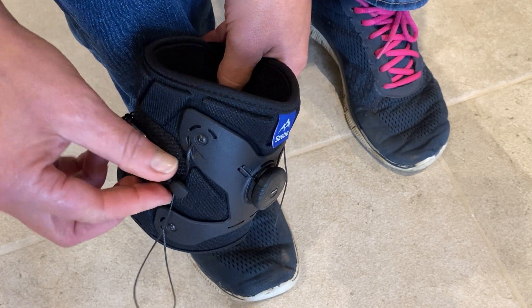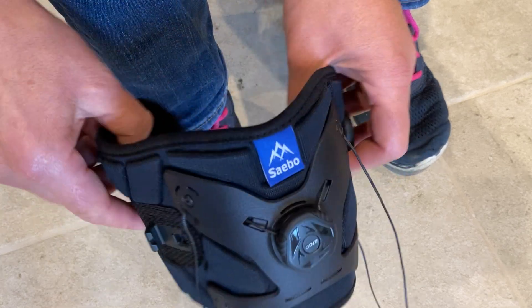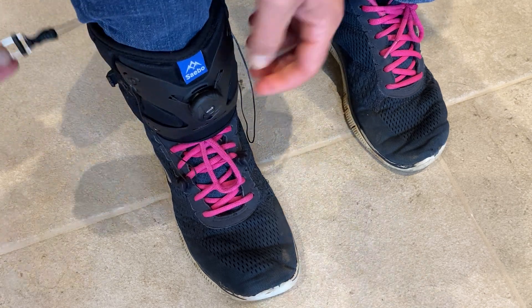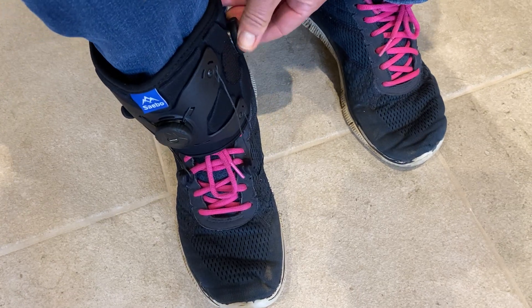I'm going to show you putting it on. I'm just going to unhook this magnetic tab at the side to open up the cuff. I already have the eyelets ready in my shoe, and take the magnetic clip to fasten at the side.